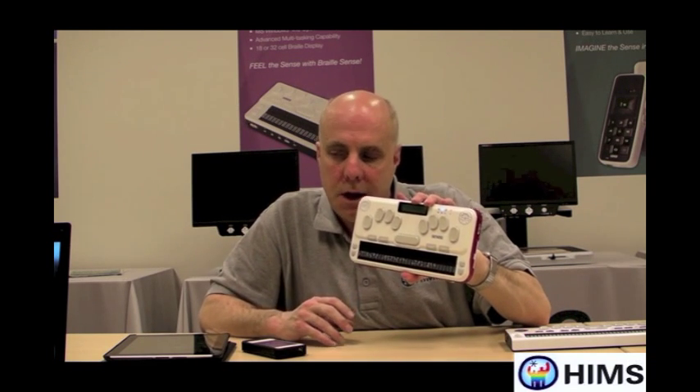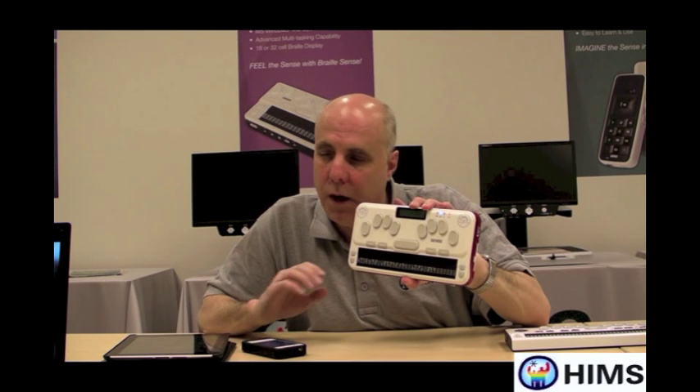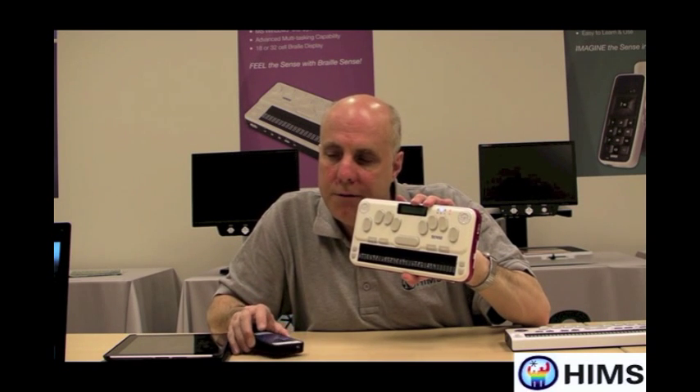Secondly, what's really neat about VoiceOver — and Apple has done a great job with this — is that if I go into Notes, or if I go to Internet Explorer or email on my iPhone, either by using the buttons on the U2 or flicking on the screen with my iPhone, I can use grade 2 Braille.